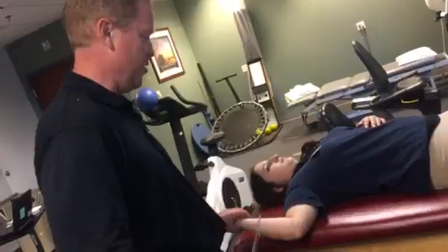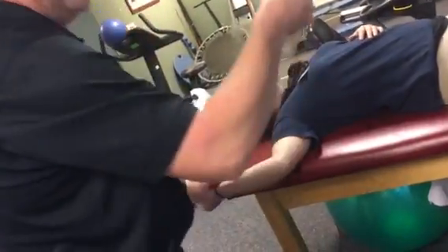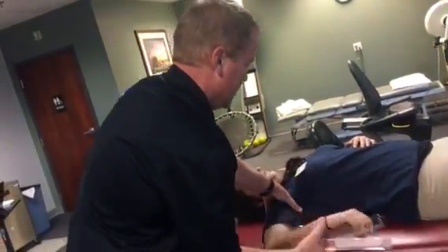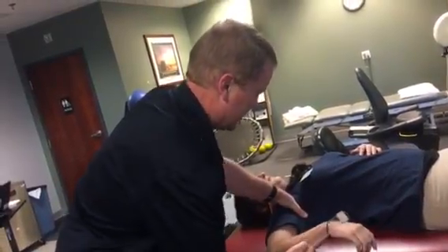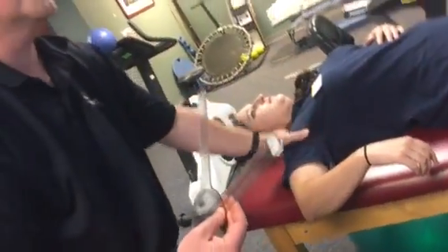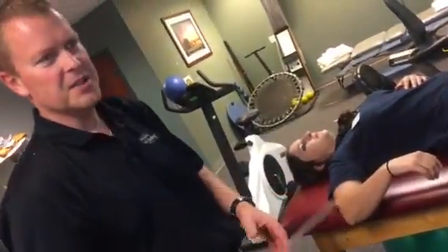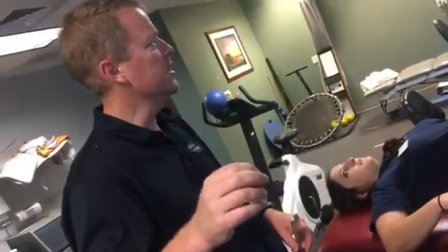So if we have Emily go back as far as we can, okay? The arc of external rotation there is 99 degrees. Okay. Then we go to internal rotation here. Is that as far as you go? Relax. And the internal rotation is 63. So we said 97, that's what we said? Plus 63. That is an arc of 97 plus 63 is 160 degrees.